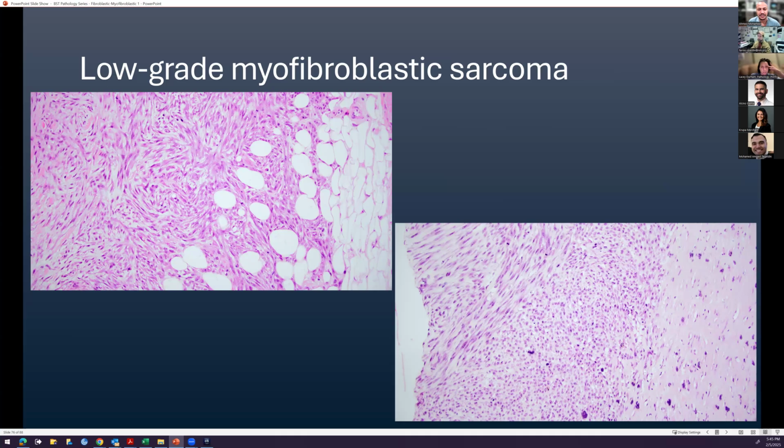To be quite honest, it's not exactly a tumor that I call at all, really. So it's just one of those weird tumors, right? It's not something that you're going to run into, I think. What do you see this look in other lesions that we have names for? Not really, to be honest. I mean, the thing is it's myofibroblastic in nature, right? But the question is, does it really deserve to be called a sarcoma or not, right? I see what you're saying.